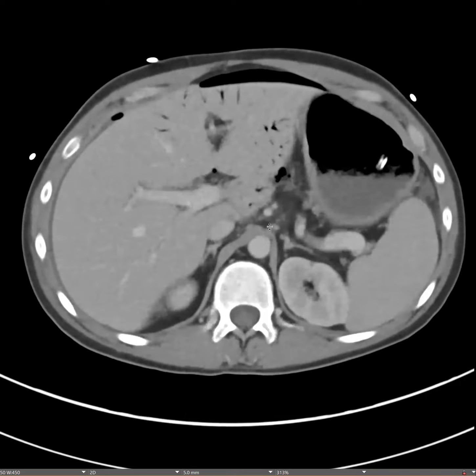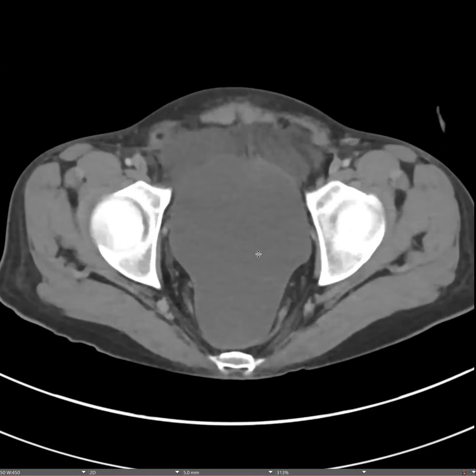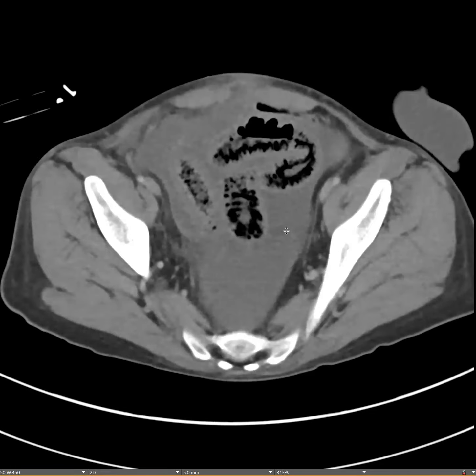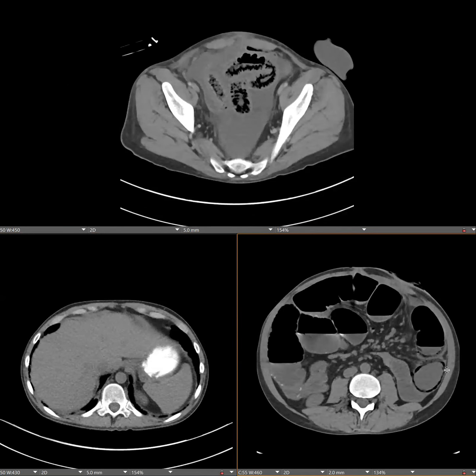And can you spell it out for us? You said a JAK mutation? Yeah, JAK2, like the alphabet, capital J, capital A, capital K, 2 mutation. I was trying to read up, and the only thing that relates to it is increased wall permeability. But on one of the CTs, there's quite a bit of free fluid and the peritoneum is thickened, and even with those imaging findings, there was still nothing in there.